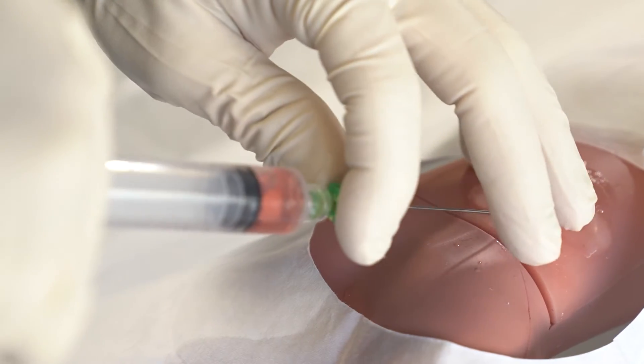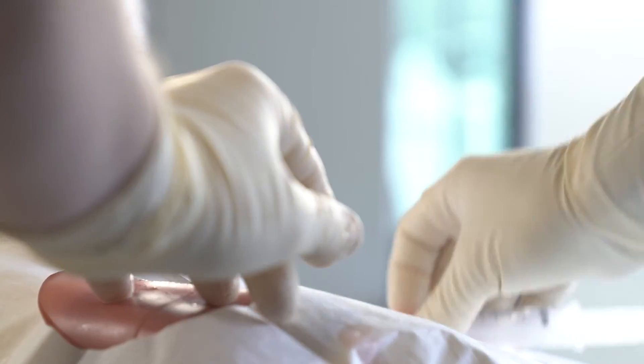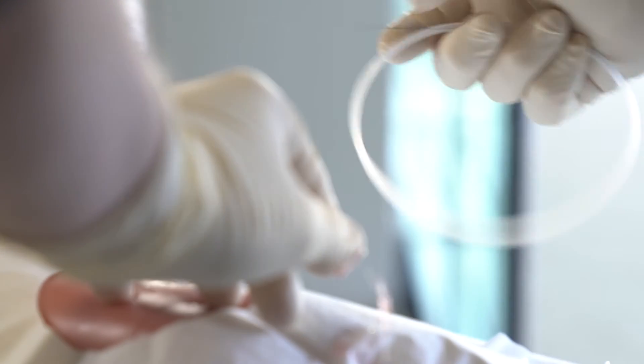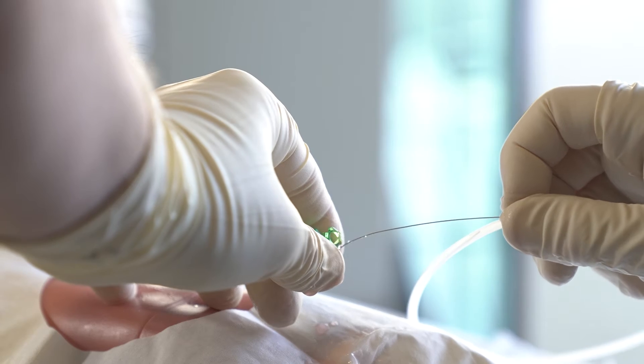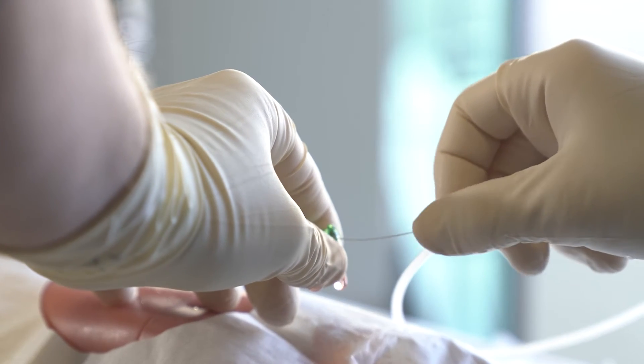Put down your ultrasound probe with the opposite hand and pick up your micro wire. Thread this through the micropuncture needle. Ensure the wire passes smoothly.